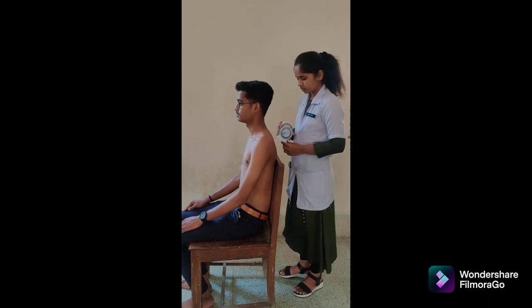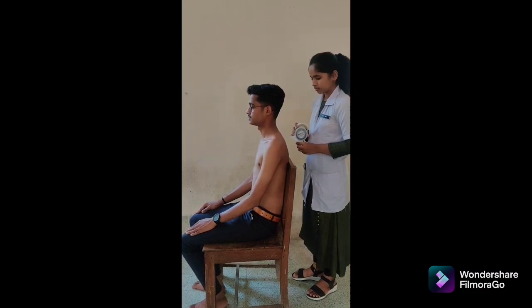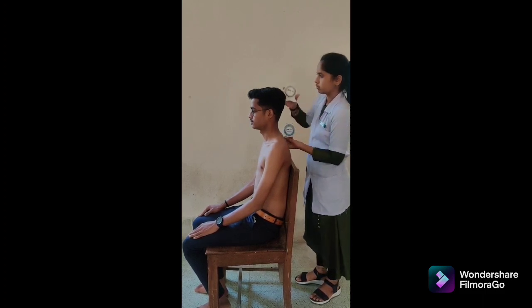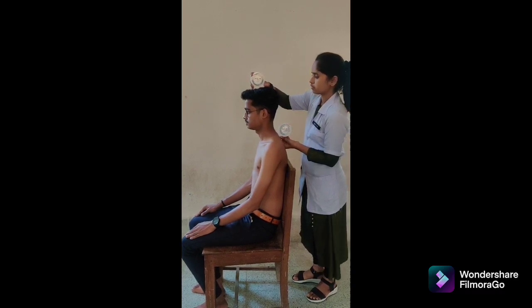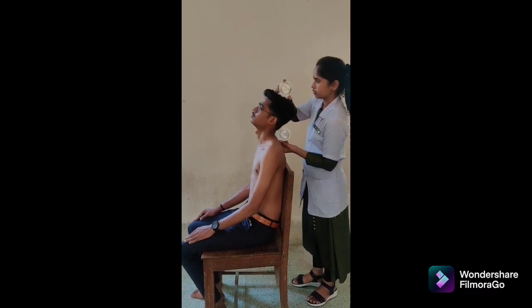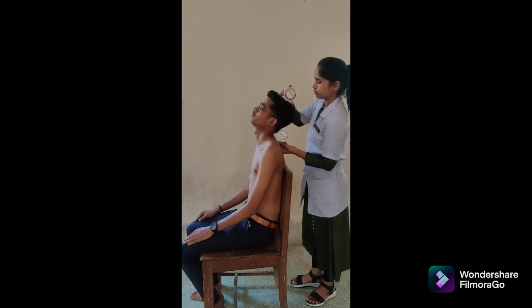We are going to perform cervical extension with double inclinometer. Patient position: sitting with thoracic and lumbar spine well supported by back of chair. Inclinometer alignment: place one inclinometer over the spinous process of T1 vertebra, and the second on the top of the head. Both inclinometers are adjusted to 0 degrees. The examiner maintains both throughout the motion. Instruction: move head into extension while keeping the trunk straight. At the end of motion, read degrees from both inclinometers. The range of motion is the difference between the two readings.